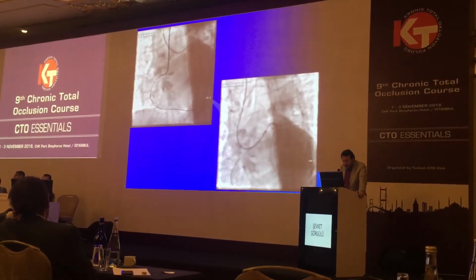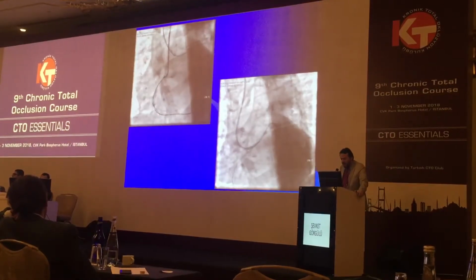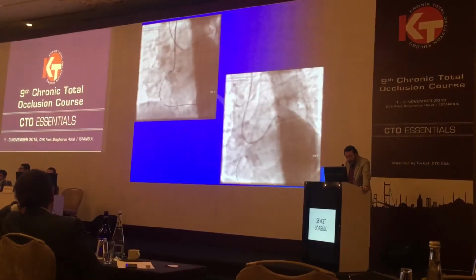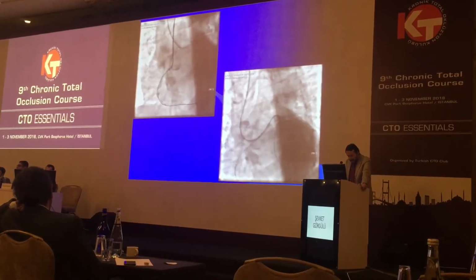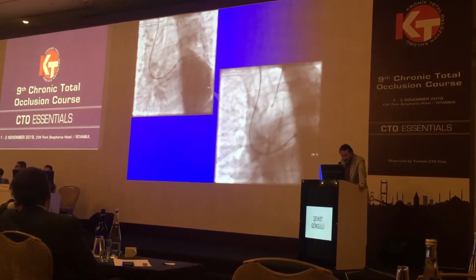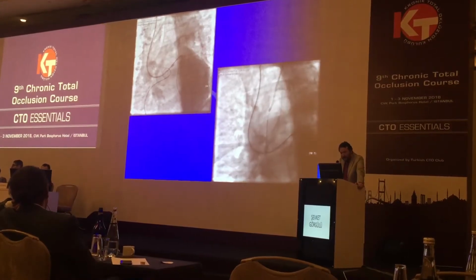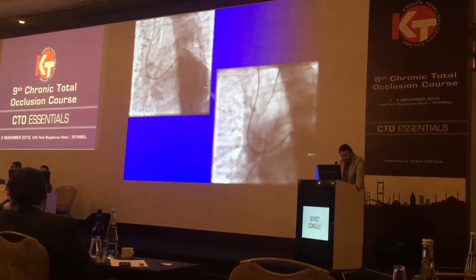To confirm that we are in the right lumen, the Corsair was left to free oscillation in the aorta by removing the RCA catheter. The tip injection from the Corsair proved we are in the right space. The snare grabbed the Fielder FC wire, and after trapping the wire, the Corsair was again advanced into the left RCA catheter. The FC wire was then exchanged with an RG3 wire.